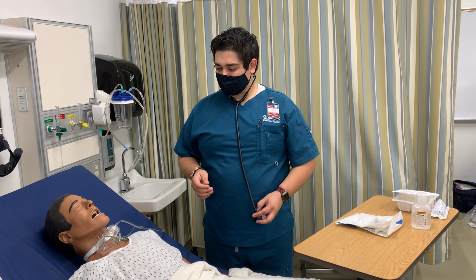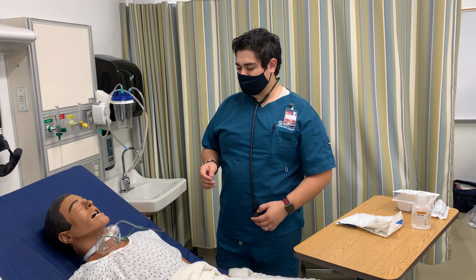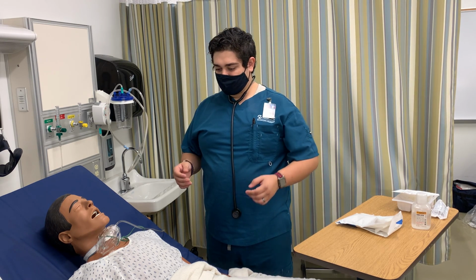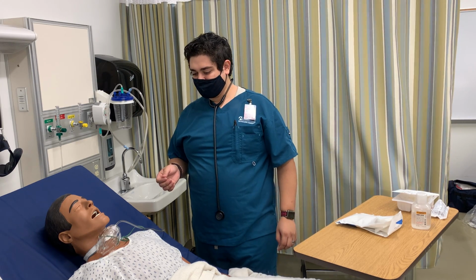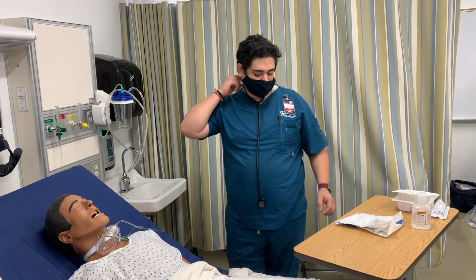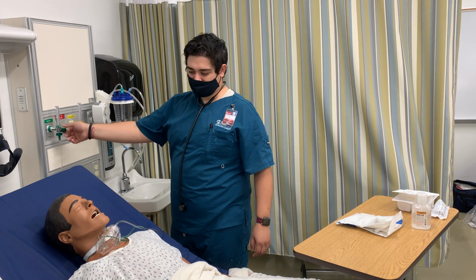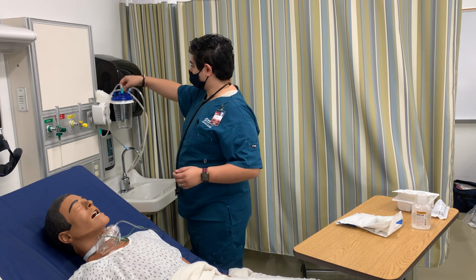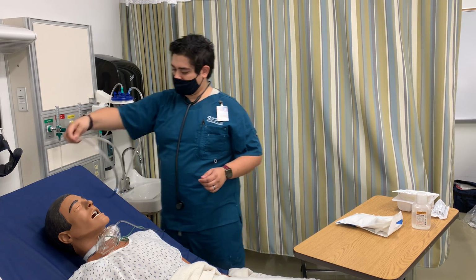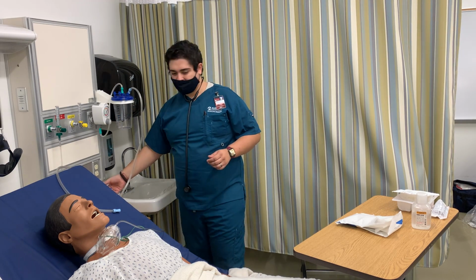And there is a need for suctioning, so before we do anything, can I have you just to mobilize your secretions? Can you give me a couple of coughs? Okay, thank you. So at this point, I will be hyperoxygenating my patient here, turning on my suction, putting this here for later, performing hand hygiene.